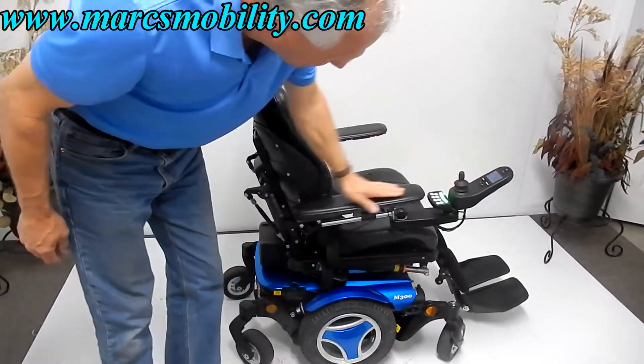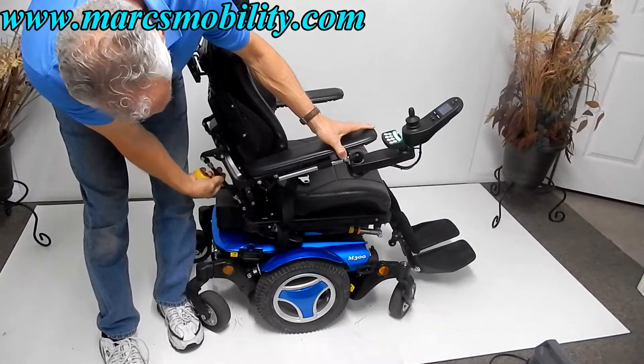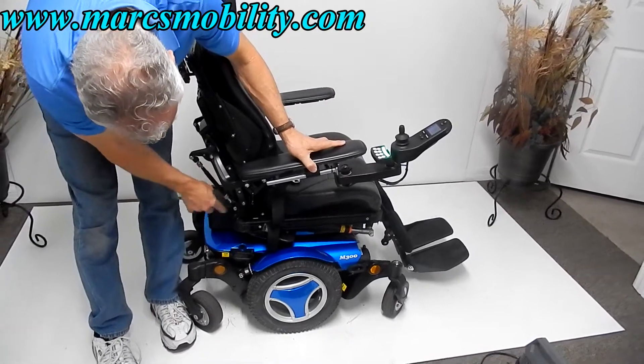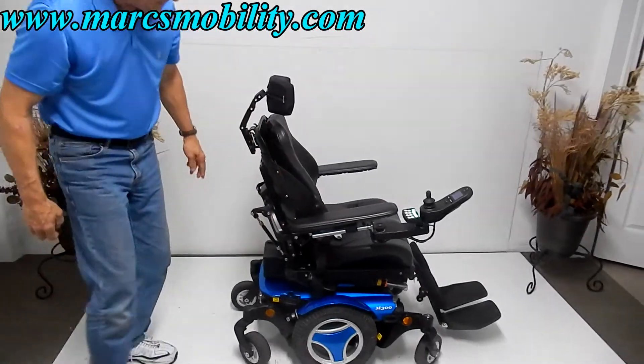If you need to adjust the tilt on the arm and want a better tilt, you can just turn the cylinder right here. You can see how the arms are tilted. Bring it back down to the position you need and then lock it in place.